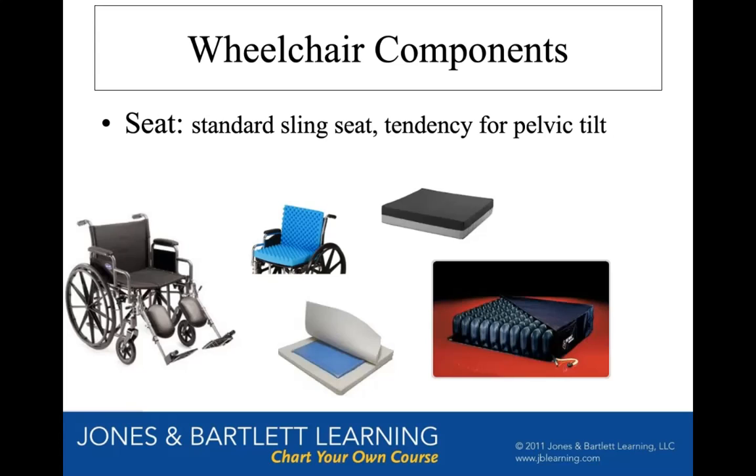So think about this. You're a spinal cord injured patient, and let's say you're a paraplegic, paralyzed from the chest down. So you've got full use of your arms, but your trunk doesn't have a lot of strength and you're real wobbly. So you're propelling this manual wheelchair because you've got use of your arms, where you're sitting on this air cushion, bumping along as you're leaning back and forth and propelling.